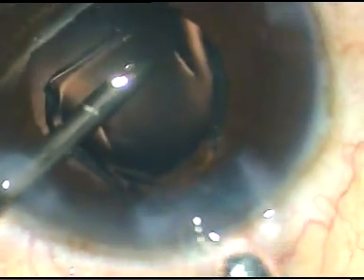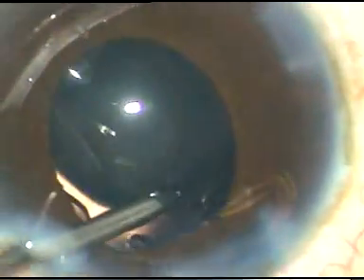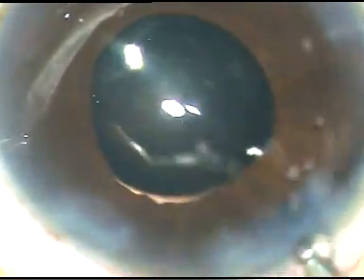Now, I am going to implant a hydrophilic acrylic intraocular lens under irrigating fluid. BSS keeps the anterior chamber formed, and the injector injects the lens in the anterior chamber. The left-hand instrument guides the lens into the capsular bag. That's it. The case is done.